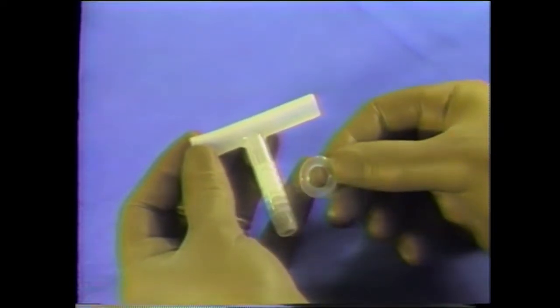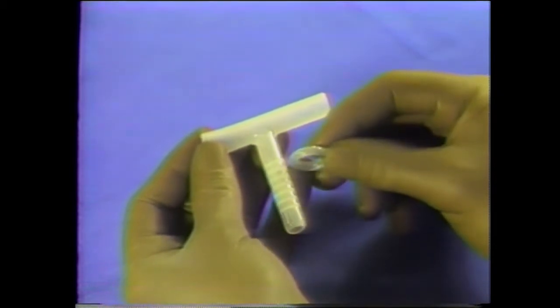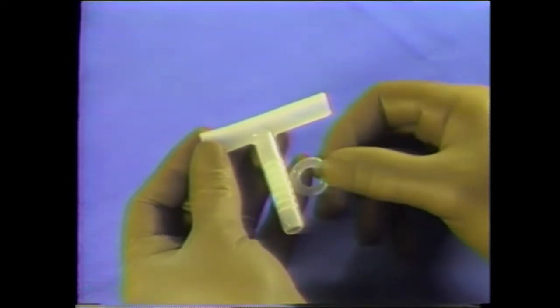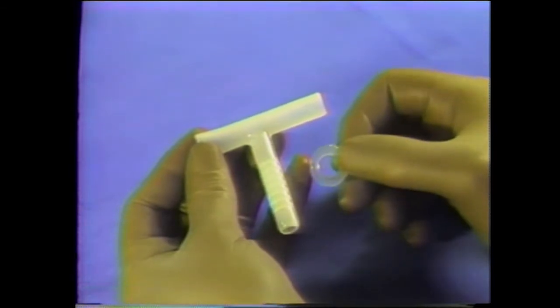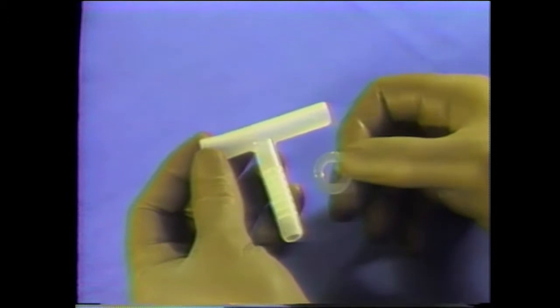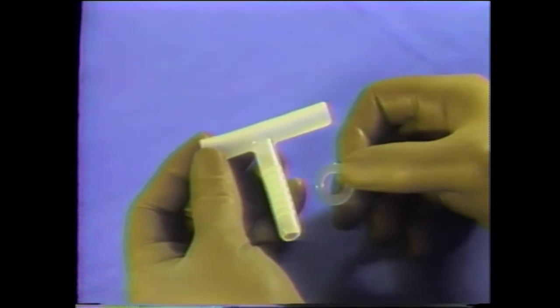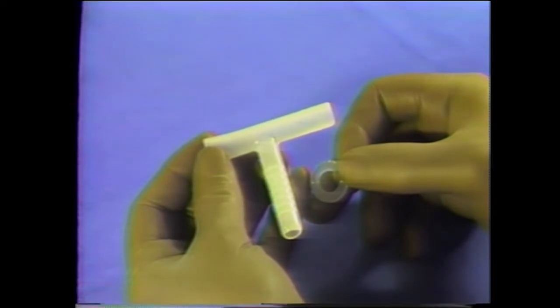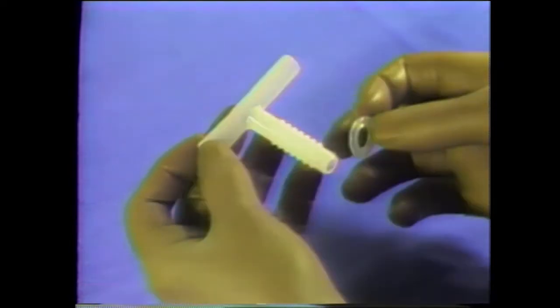The safety tube is designed to maintain an adequate airway as well as to provide support in the stenotic trachea which has been reconstituted or reconstructed. Our exclusive design of ridges and grooves along the extraluminal limb of the safety tube allows a ring washer to be attached, significantly reducing the possibility of accidental posterior displacement.